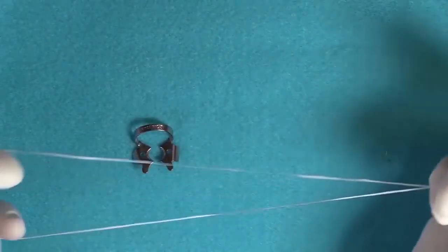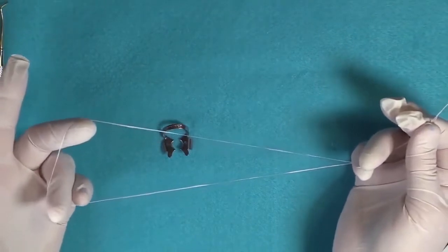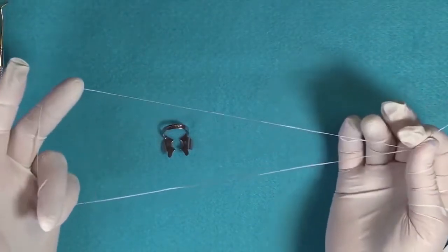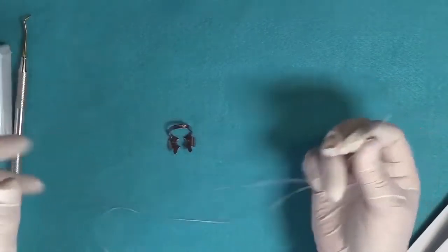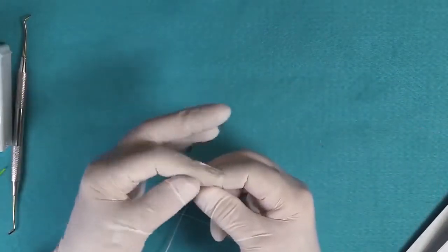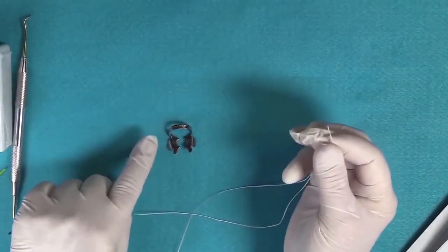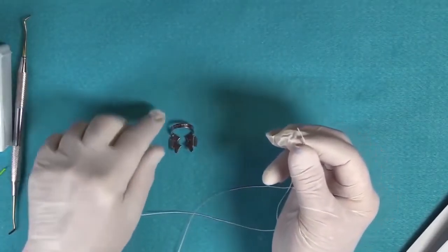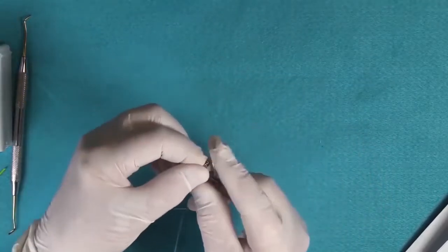So what I usually do is get a piece of floss that is as wide as my shoulder, and then I fold it in half. And notice I have a loop at one end and I have a little twirled threading end here. Now we're going to engage the clamp so the floss is threaded through the lingual side of the clamp.